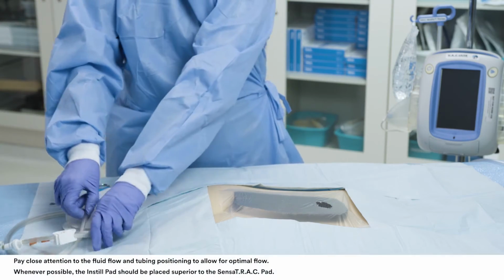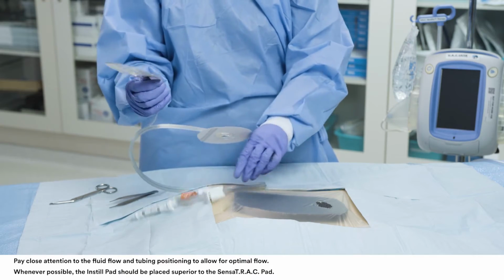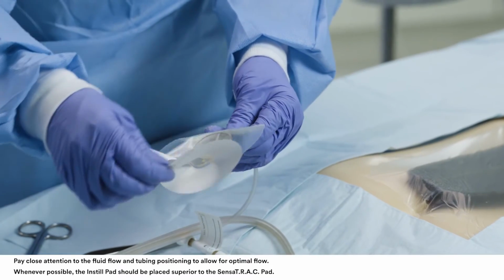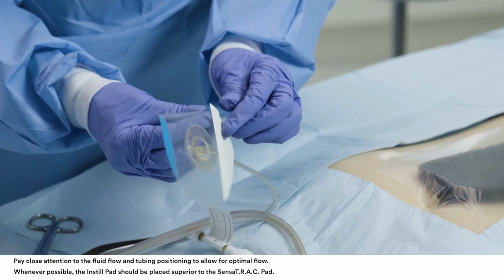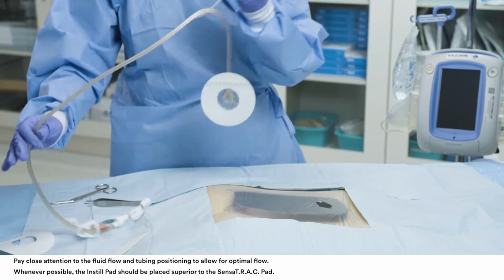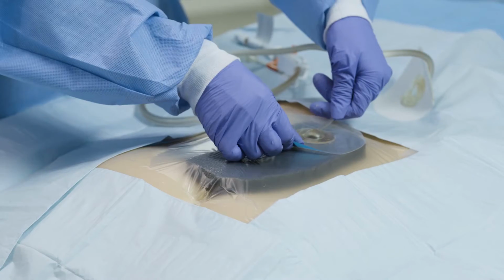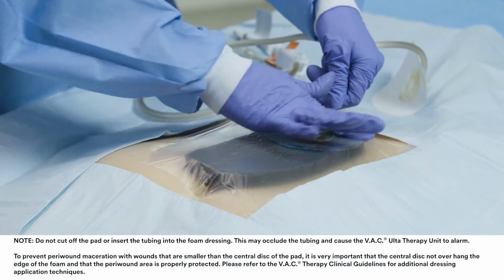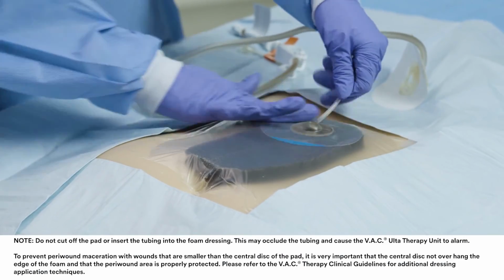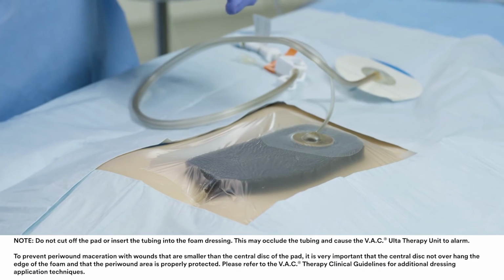The Instill Pad has a central disc and a surrounding outer adhesive skirt and the smaller diameter tube. To apply, remove both backing layers 1 and 2 to expose adhesive. Place pad opening in central disc directly over the hole in the drape. Apply gentle pressure on the central disc and outer skirt to ensure complete adhesion of the pad. Pull back on the blue tab to remove the pad stabilization layer.